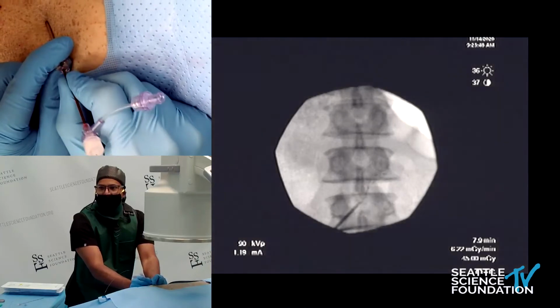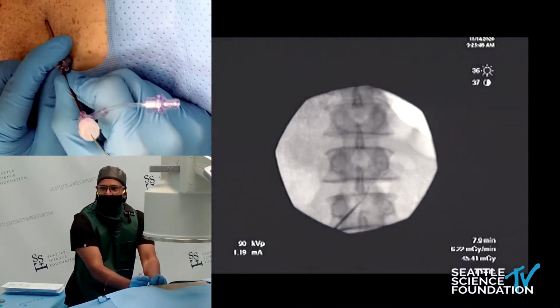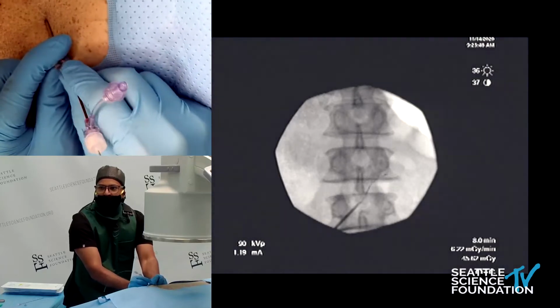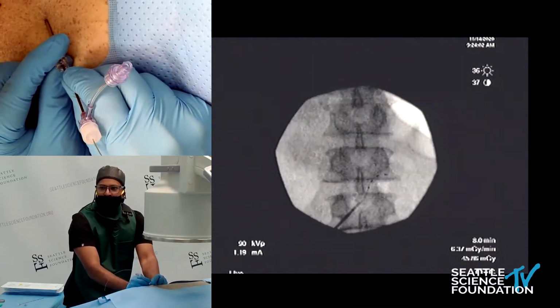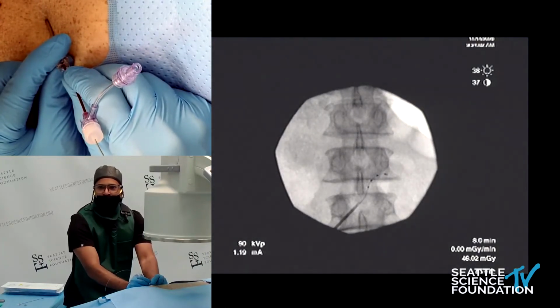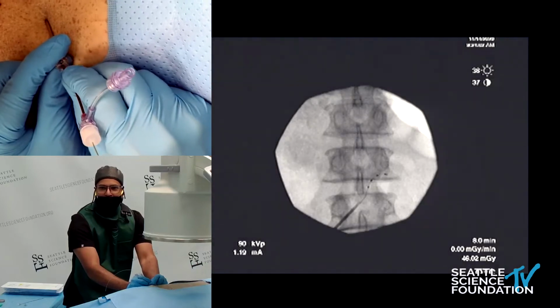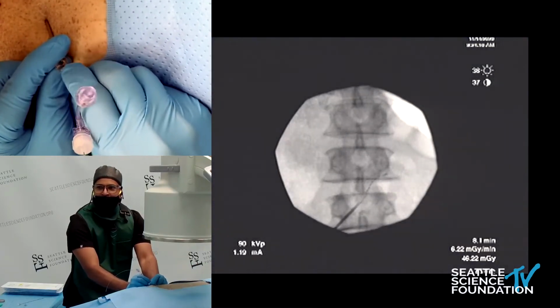And you can see I'm doing sort of a punch technique, and I'm just breaking my way in. I'm wiggling, I'm twisting the sheath. Another technique in this situation is to just hold firm pressure, talk about the groceries with your scrub techs, what you're going to buy later that evening, and then try punching again. And again, it's just patience.